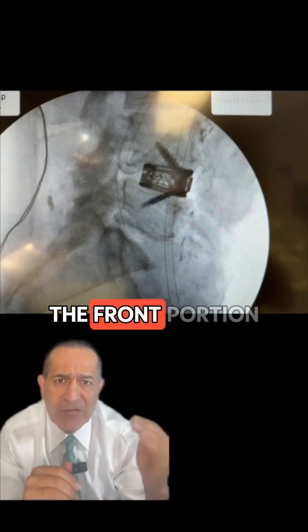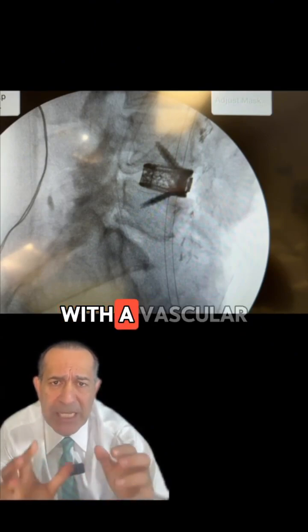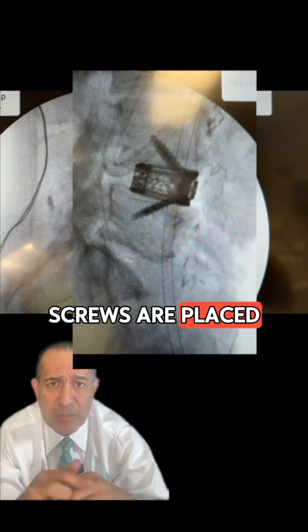Usually, however, the front portion of the procedure is done first, with a vascular surgeon approaching the spine and accomplishing the fusion from the front. In this implant, screws are placed and this is called a stand-alone cage.